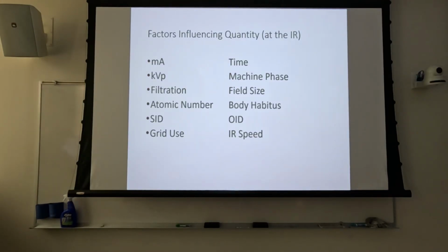If we have an increase in bone density, we might want to increase kVp. If we have a decrease in bone density, we might want to decrease kVp. So that's where we have osteoporosis. We want to decrease kVp potentially. And if we have osteopetrosis, we will want to increase kVp. And the purpose for that, especially with osteopetrosis, would be that we wouldn't be increasing patient dose, right?